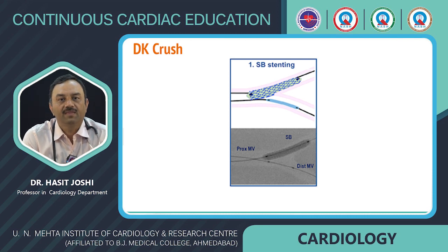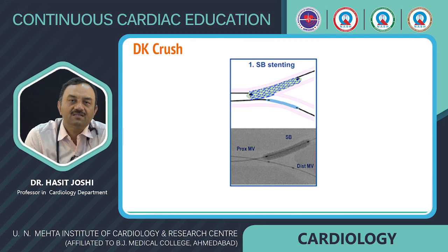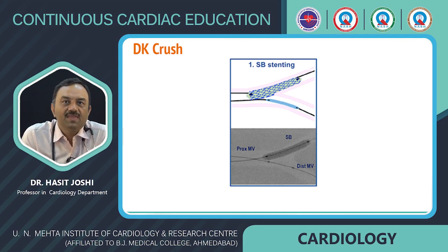Now culotte stenting. Culotte stenting is another method which was used. However, its results versus DK crush are inferior, and hence it is mostly obsolete in recent practice. So DK crush is more cumbersome. However, the long-term results with DK crush are much better.